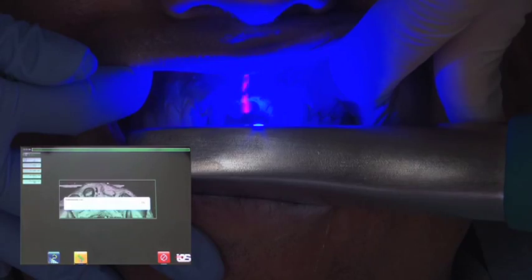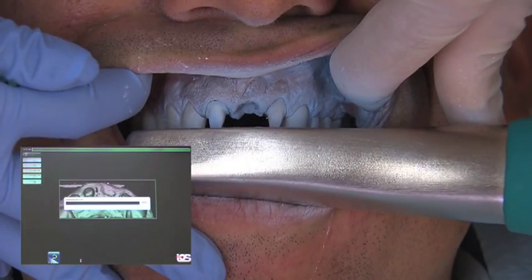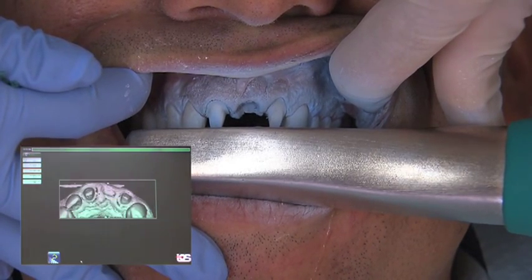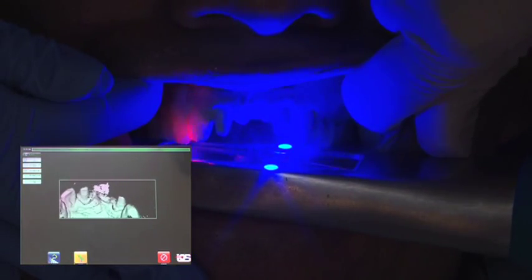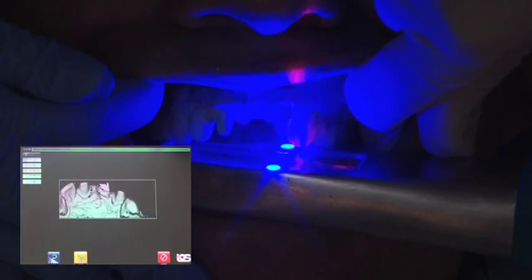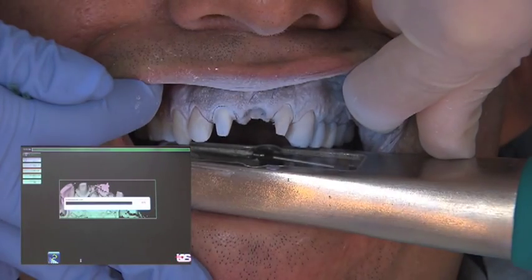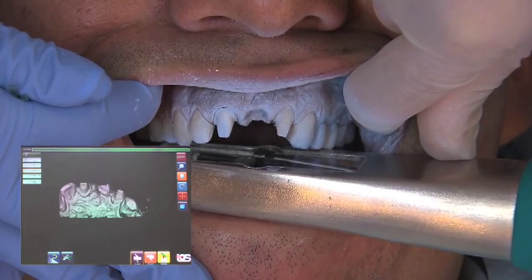The big thing about the iOS fast scan that I love is that you'll notice I don't have to move the camera at all. When it finally scans, as you see that line going from side to side, it does the entire quadrant without me moving the camera. The camera is actually inside the wand, moving back and forth on its own, so you don't have to move from tooth to tooth to take a picture.